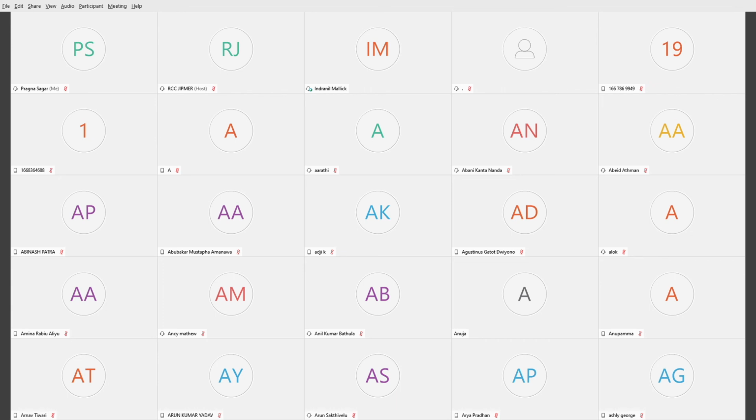Thank you, sir. Sir, since the issue of clips came up, how do we differentiate between prostate bed clips and hemostatic clips? And in case of discrepancies, would you include hemostatic clips also in the post-op tumor bed volume? I think I'd use my common sense, and if it's in an area where the cancer or the seminal vesicles could be, then I would include it.